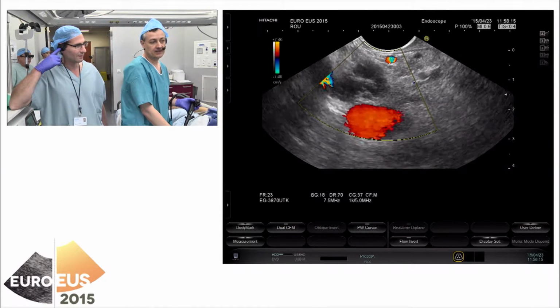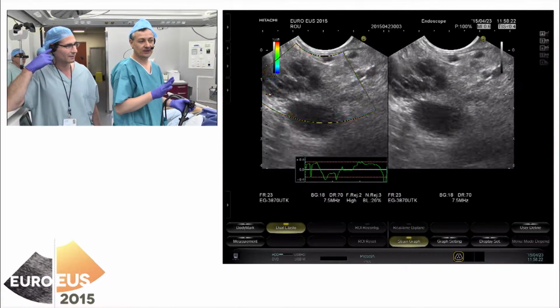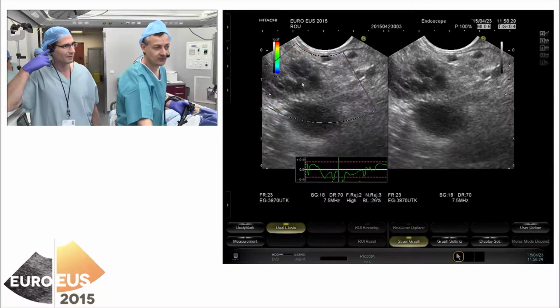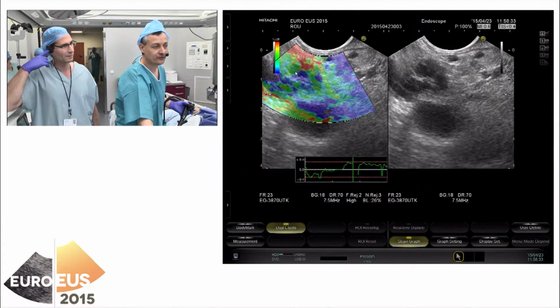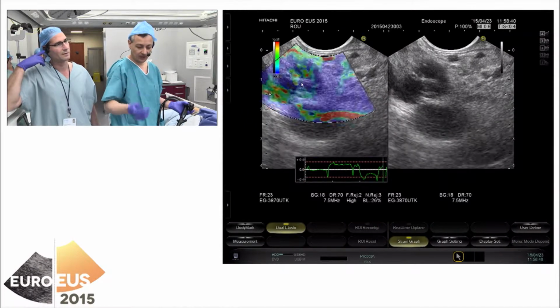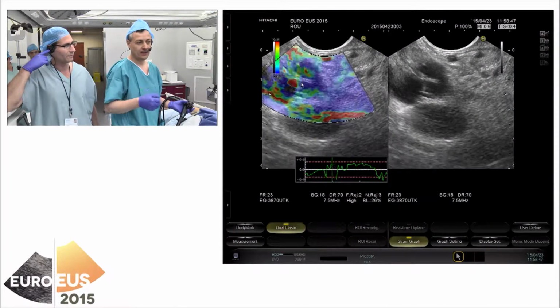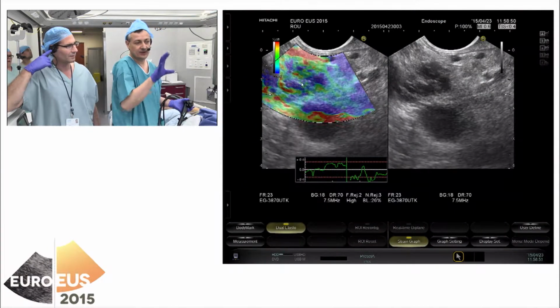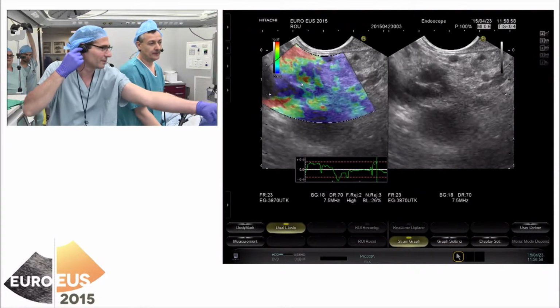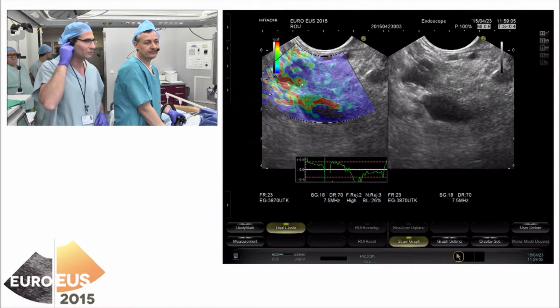The other thing is that, of course, the next question would be if we can use elastography. We can, of course, use elastography. You see that the images are really nice, reproducible, but what you see on the cystic lesion is a lot of artifacts here. Because of the cystic masses, you get a lot of tricolor artifacts. So you see a lot of artifacts inside the lesion, which are also a characteristic of cystic masses. So again, we have an idea that this is a combination of small cysts. Here you have, if you turn the scope, IPMN. If you turn it, you have a serous cyst with a central tissue.